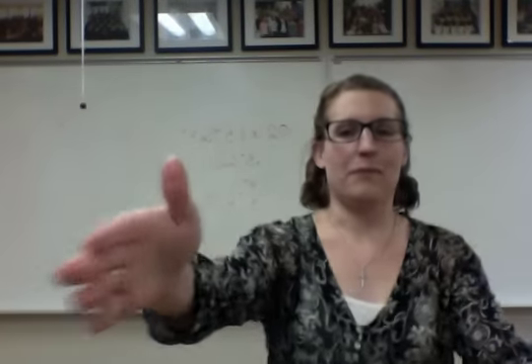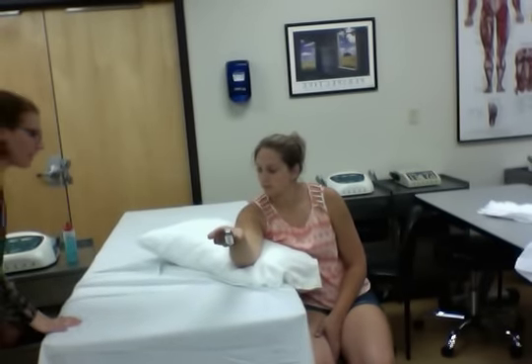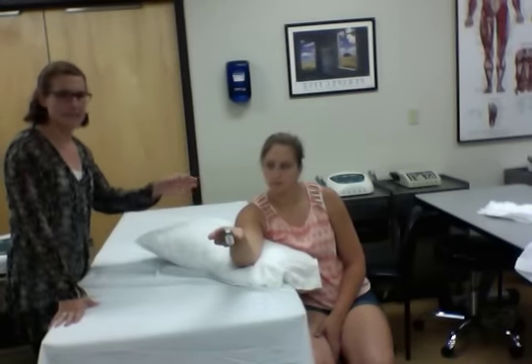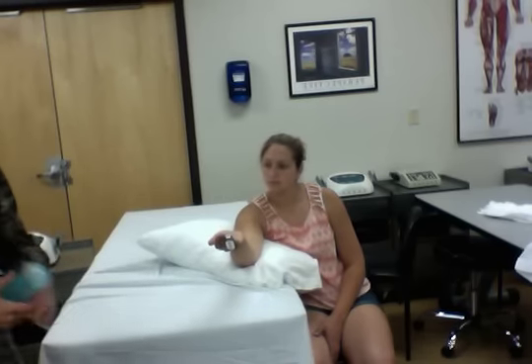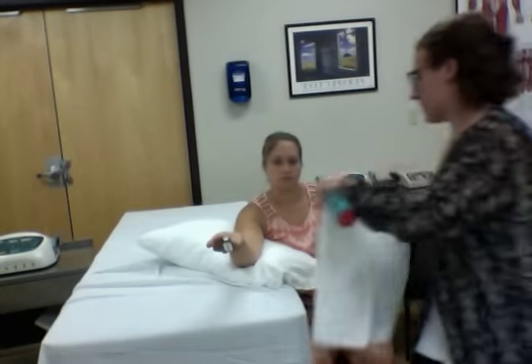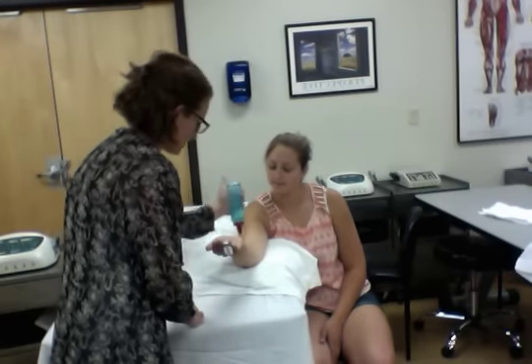So we'll pivot back to Jason here. All right, now are you comfortable in that position? And she's reclined back against the seat, so she's nice and comfortable for her treatment here. And I'm going to put some gel on your elbow. I'm going to put some gel on the front side of your elbow. This is kind of cold. Okay.